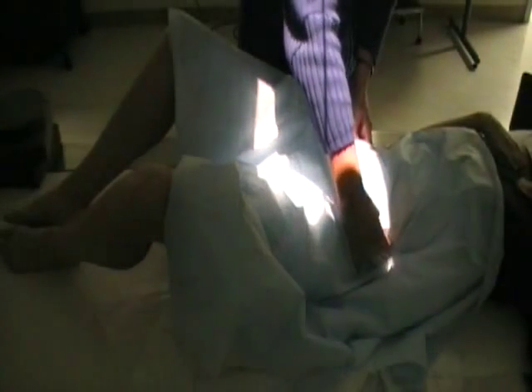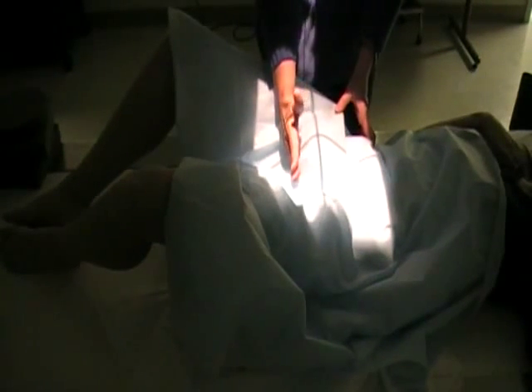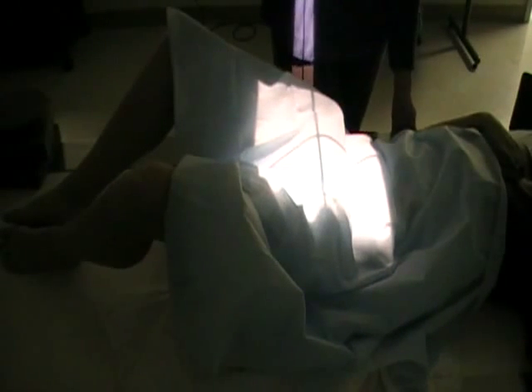And again, it's called the bilateral frog leg for the pelvis because it's getting both of the hips on there. And again, you can check your centering, make sure that you have the crest included. And then for this, you really only have to be an inch above the pubic symphysis on the bilateral. Okay, so that's our center.